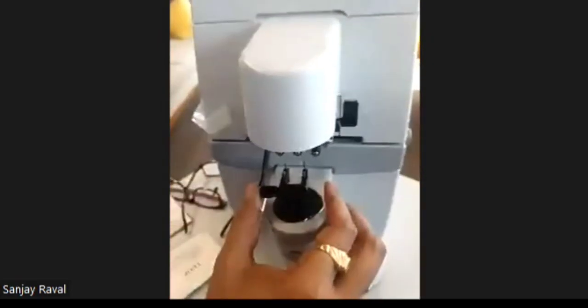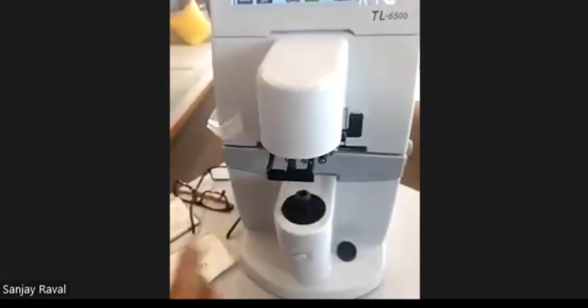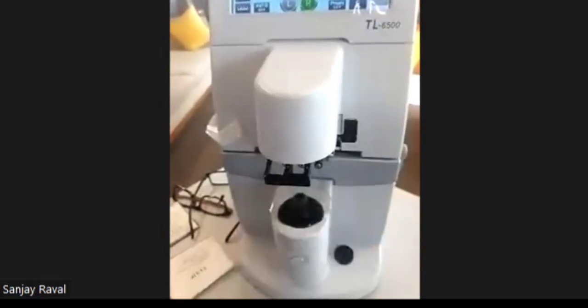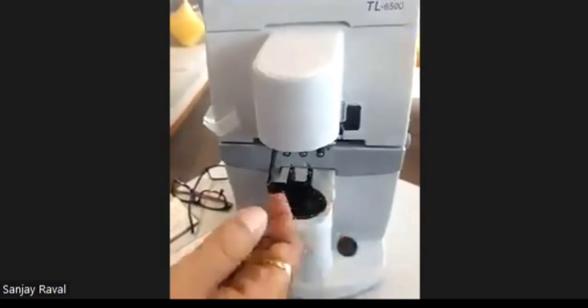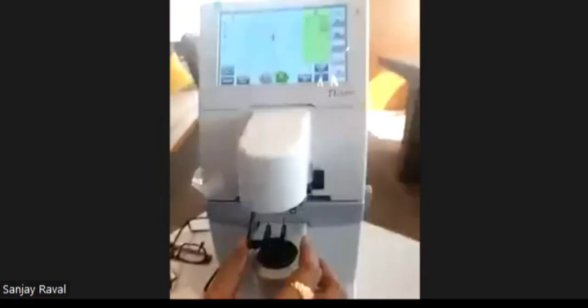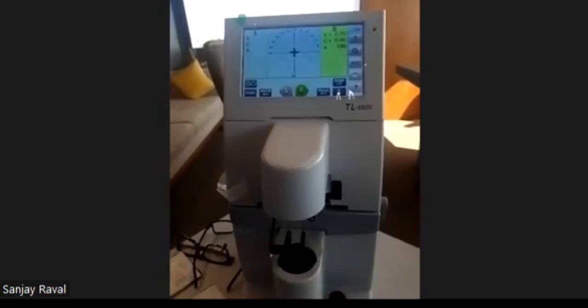Right, coming down to the measurement part, this is a lens holder. We used to call this a lens stand, where we put the lens. The tip of this lens stand is soft black acrylic, soft silicone, which never hurts or damages the lens coating as well as the lens. And we recommend that to begin with, we should always keep this on, which keeps your lens stable and perfectly horizontal. And we just need to move it. Coming down to center, this is auto off.